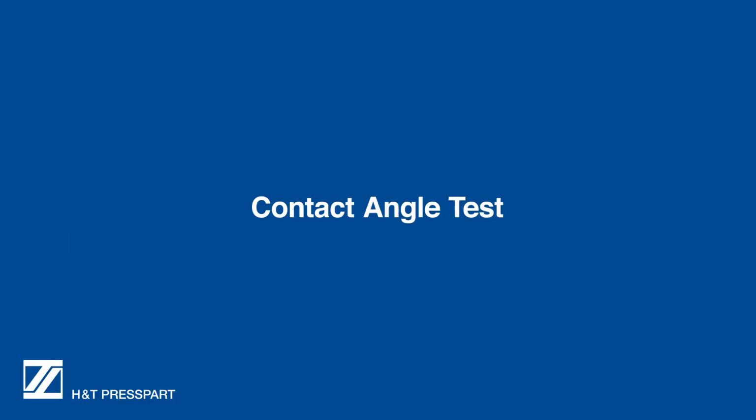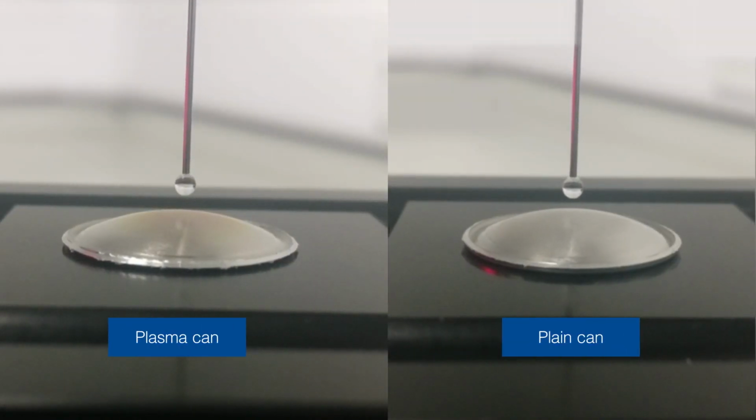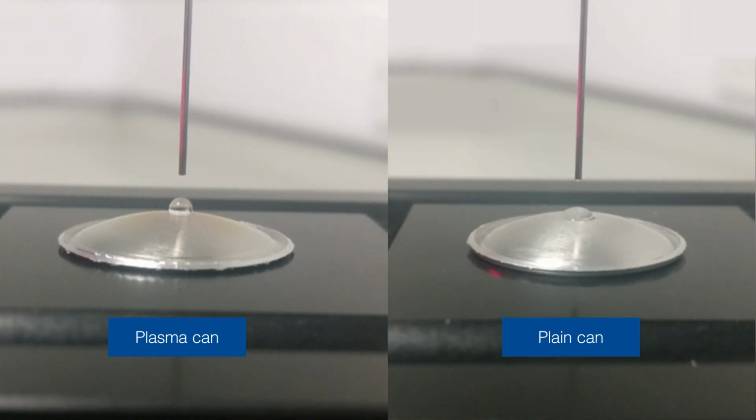The final test is contact angle, which tests the repellency of plasma using a tensiometer. A water droplet is placed onto the can base, which appears more rounded on plasma cans, so having a higher contact angle, and less rounded with the plain can, so having a lower contact angle.